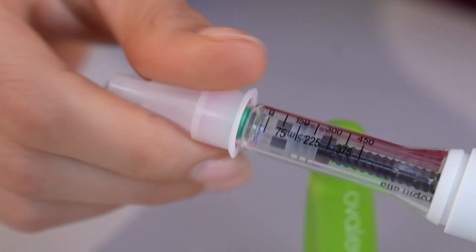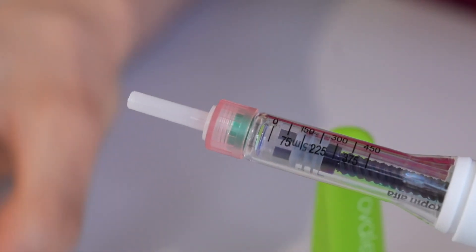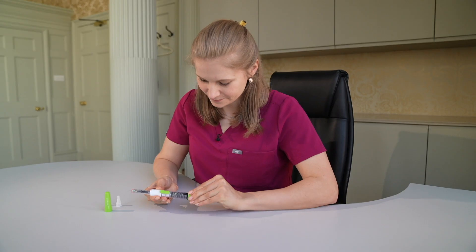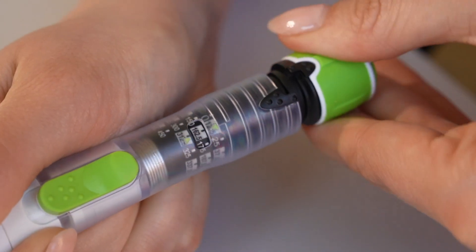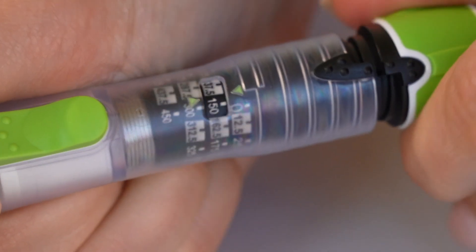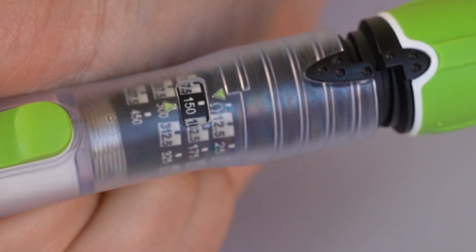Then remove the outer and inner plastic caps. Now we need to set the dose. Twist the green top of the pen whilst looking at the display of the dosing window to ensure that you set the dial to the dose you've been prescribed. Don't worry if you move the dial too far — you can press the top of the pen to reset the dose. I'm demonstrating 150 units. Once at your correct dose, the pen is ready for use.